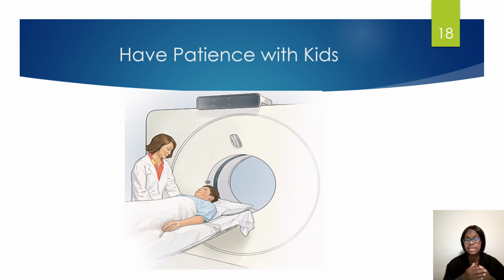Realize and understand that the patient may be afraid or nervous. It could be their first time, especially if they are high off the floor with the table being raised up. Just let them know to stay on the table so that they do not fall or injure themselves. You can also put the safety belt across their waist just to make sure that they know not to get up.